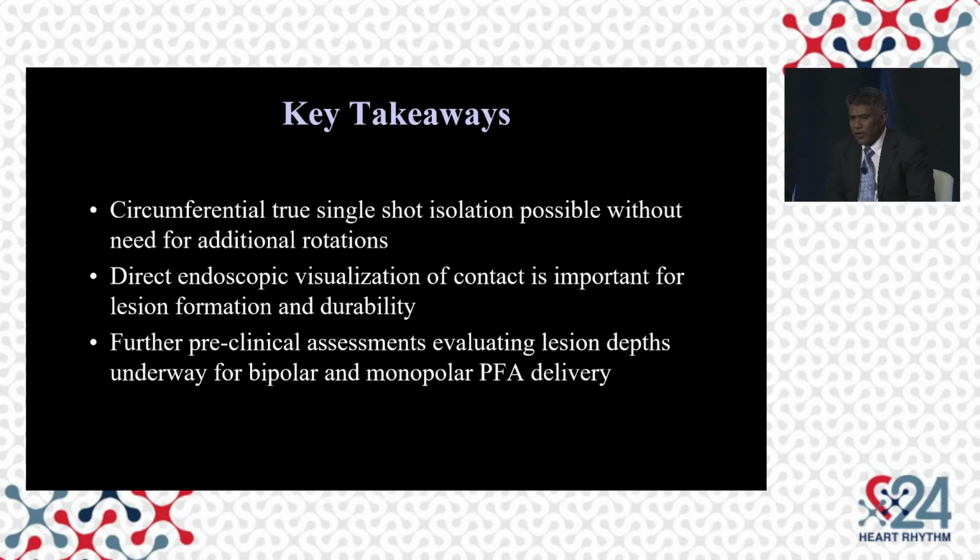And the key points: circumferential true single-shot ablation is possible, and hopefully this preclinical data will tell us what dose and regime will get us there. Direct endoscopic visualization of contact is important, like I just demonstrated, and obviously lots more work to be done, but I think we're on the right path to something exciting.